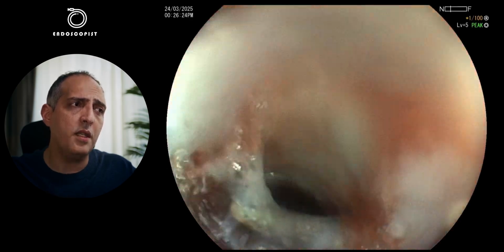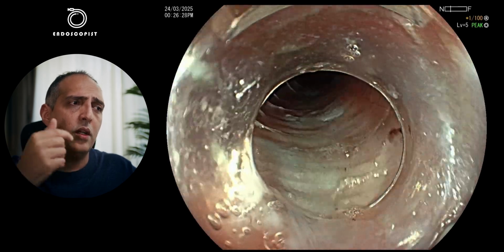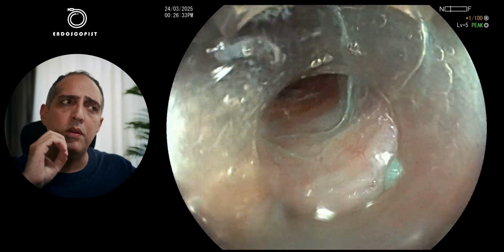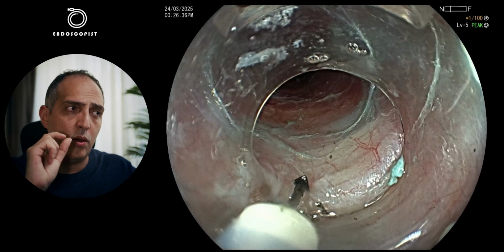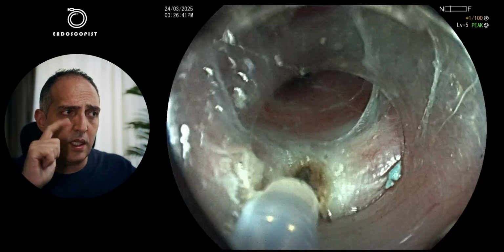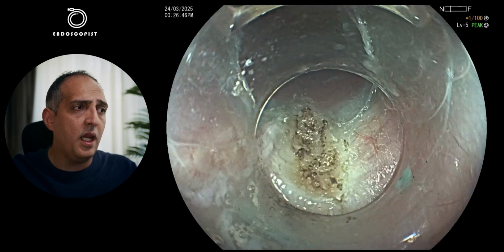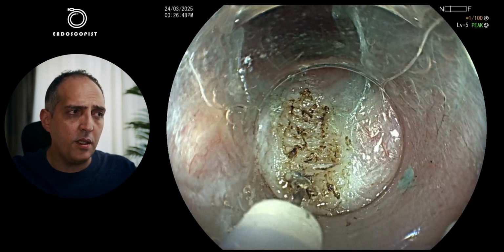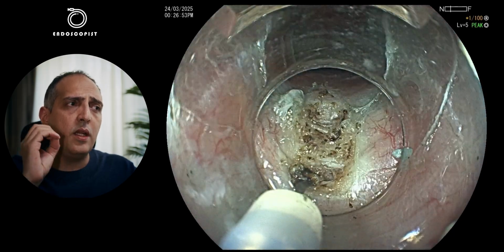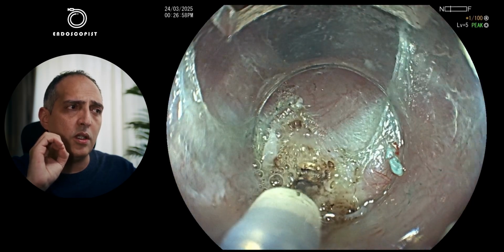After we finished our tunnel, I was just inspecting that everything is okay. Then I will go out from the tunnel, then I will go again, and I will start my myotomy about 3 to 5 centimeters below our opening, to have 3 to 5 centimeters of intact muscle and mucosa, which will help to seal the tunnel after that. I start with minimal coagulation on the circular muscle because my aim is always to do selective myotomy. So I do some coagulation of the circular muscle with the spray coagulation till I have exposure of the longitudinal muscle.